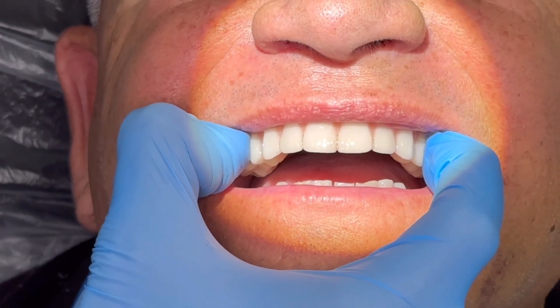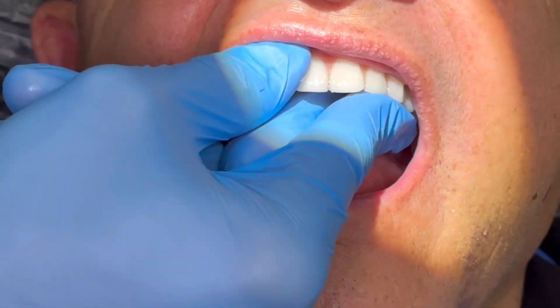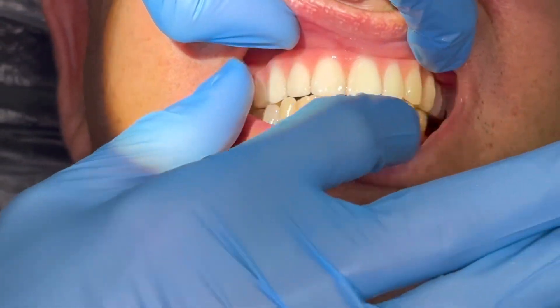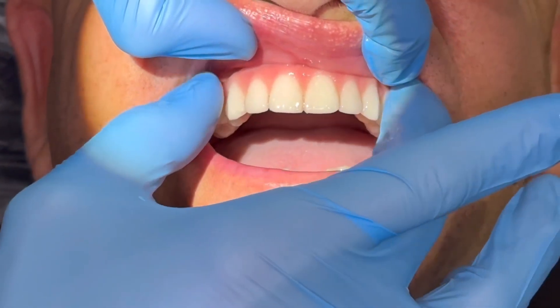You can see here I'm just demonstrating we have great retention or suction on the denture. Overall with this technique we've been using, I've been getting great results. This patient had minimal pain after surgery and was quite happy with the look and feel of his immediate digital denture.